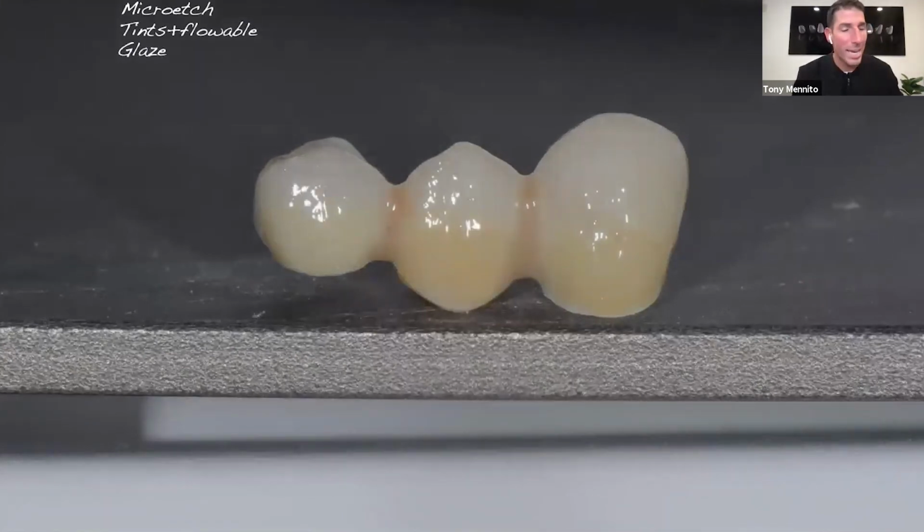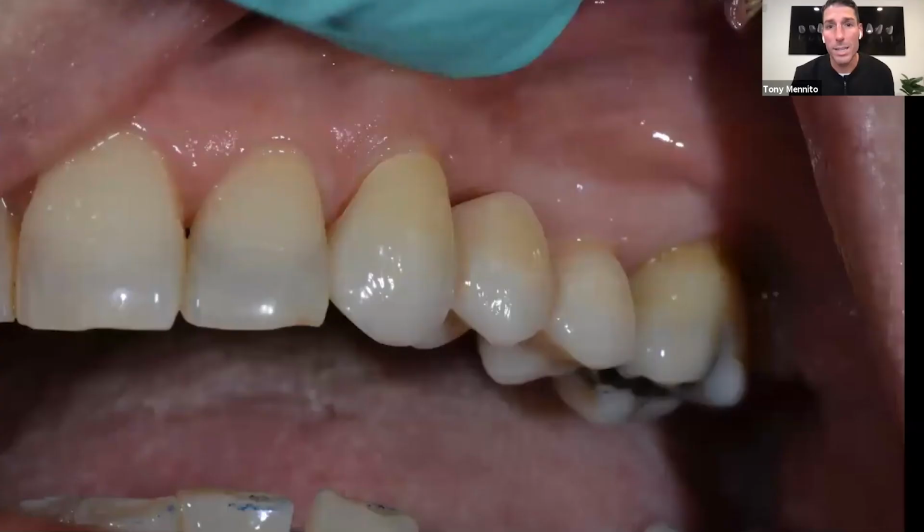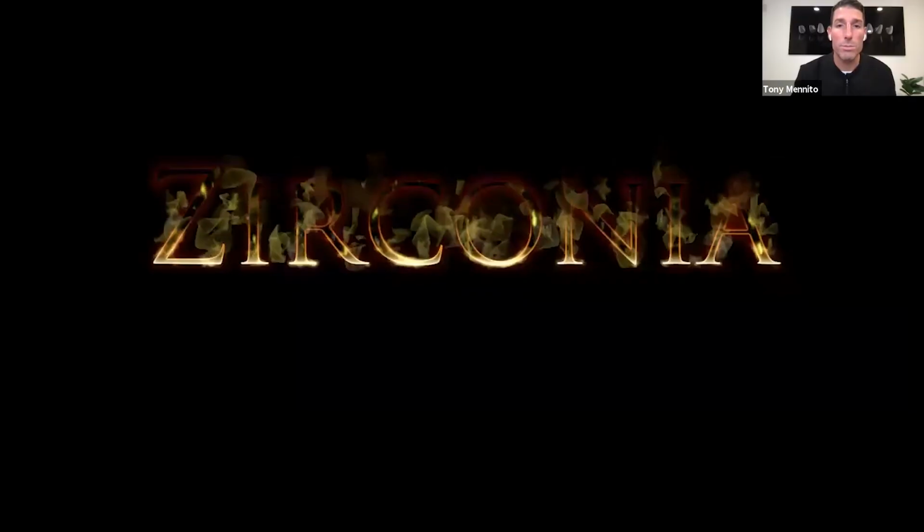And as I held this in my hand, after I did it, I was like, this is hideous. And then we ended up trying it in the mouth, and it looked pretty darn good. So PMMA could be a good long-term temporary. This was in her mouth for almost a year and held up really well. So that's an option for you as well.